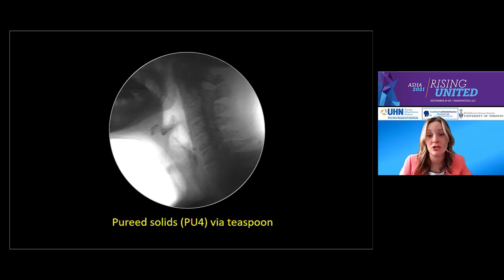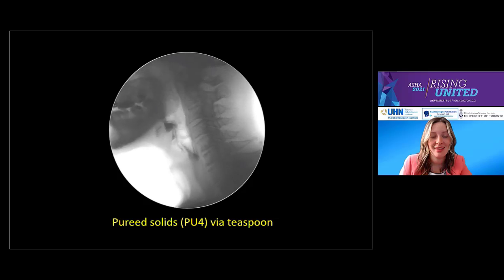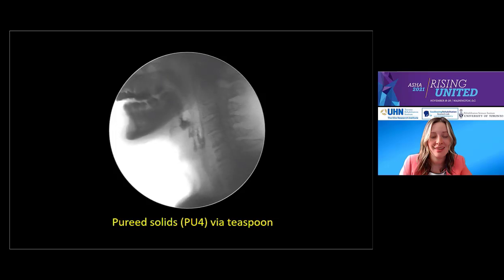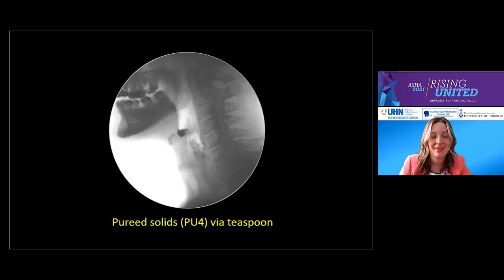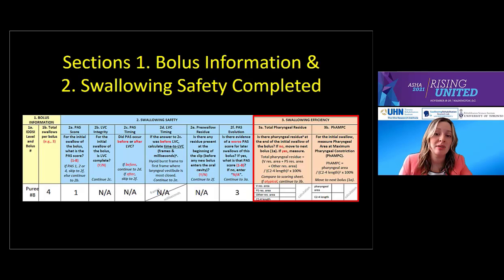Let's review a bolus of pureed solids he trialed and go through our ASPECT-C analysis logic together. In this clip, he's swallowing a teaspoon of pureed solids — the eighth bolus in our fluoro exam. He swallows four times. The PAS on the first swallow in the clip is a pass of one. As a result, we skip forward to 2F, PAS evolution. On sub-swallows of this bolus, swallowing safety actually worsens, and the patient scores a PAS of three.